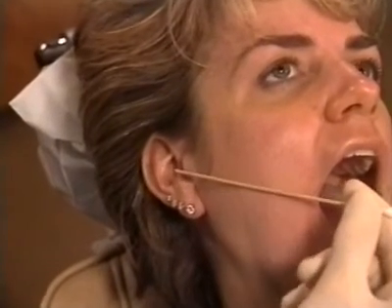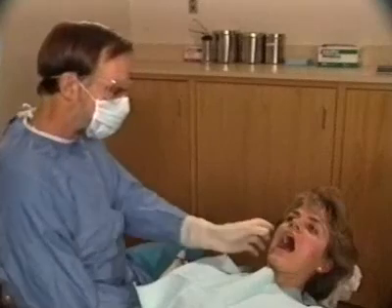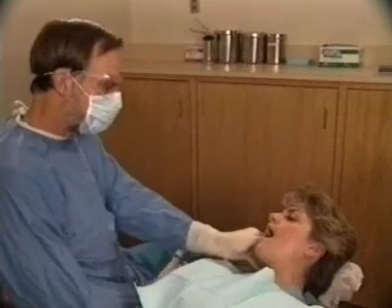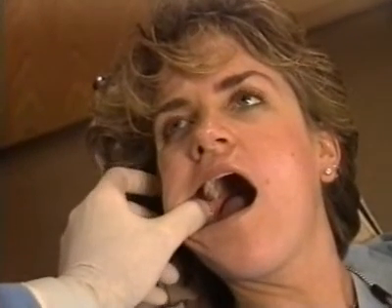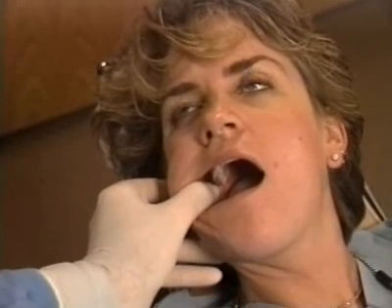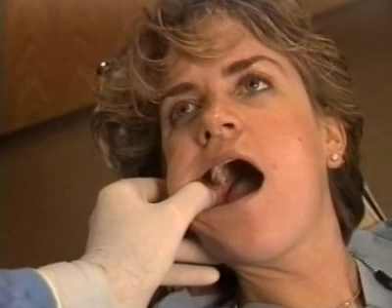External landmarks, the angles of the mouth, and the inferior border of the tragus are visualized, and the plane of insertion identified. The flare of the tragus is also evaluated to determine the angulation of the syringe within the insertion plane. The cheek is then retracted with the left hand. For convenience, the thumb may be placed on the anterior border of the ramus. The index finger may then be inserted in the intertragic notch and thus behind and lateral to the condylar neck to provide a tactile target for the needle.